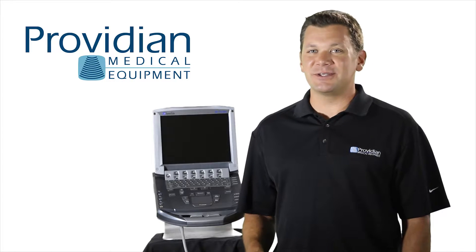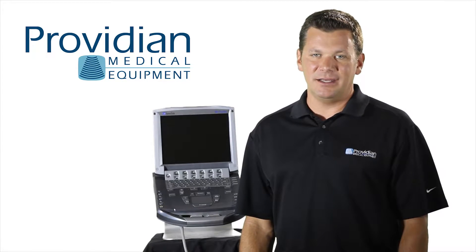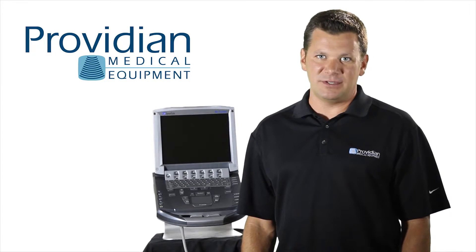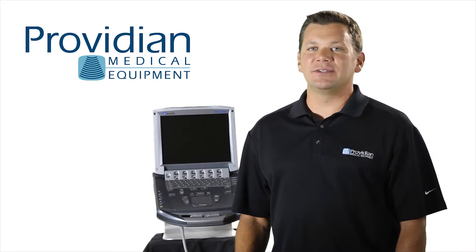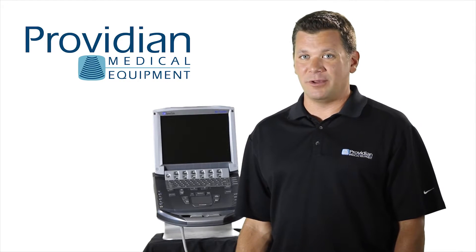As with all Sonocyte products, these are the most portable, lightweight, and durable ultrasound machines on the market. The M-Turbo boots in about 15 seconds which makes it great for emergency medicine, anesthesia, and any situation where it's often used for minutes at a time, not hours. The transducers are drop-tested and machines can withstand more abuse than the standard portable ultrasound machine.